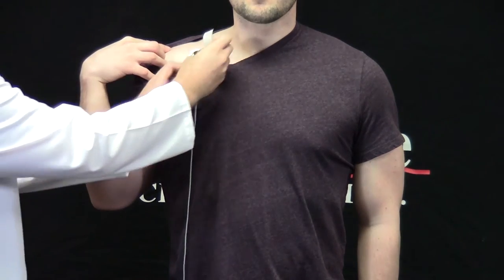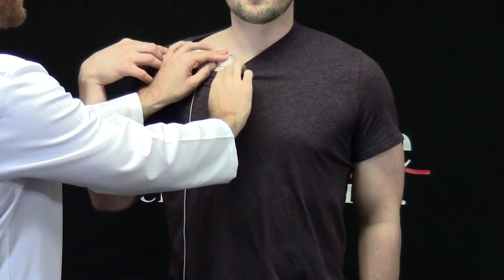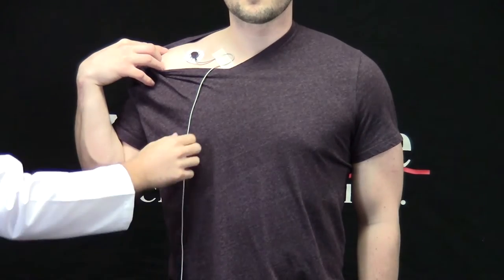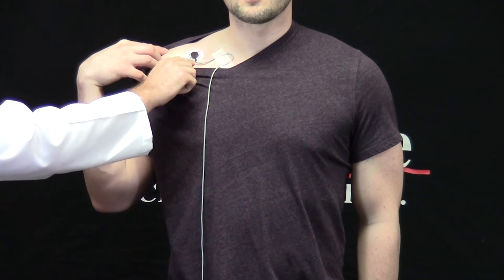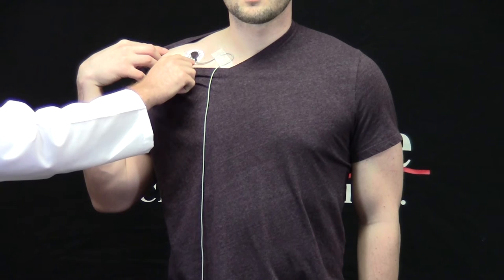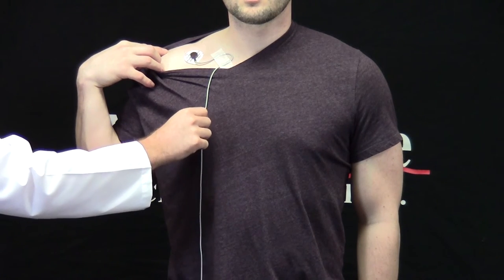Finally, I'm going to take a piece of micropore tape and create a service loop next to the sensor. We can see that when I tug on this lead wire, the tension is applied to the service loop as opposed to the electrode, allowing it to maintain connectivity with the skin. This is done to minimize movement noise caused by tugging on the electrode wire.